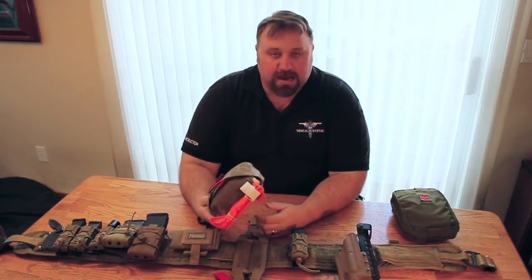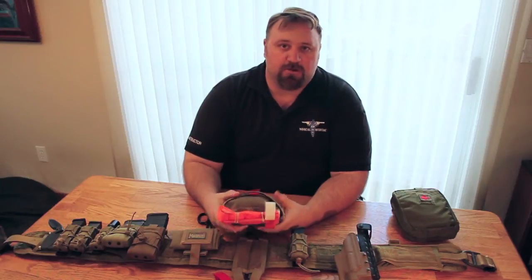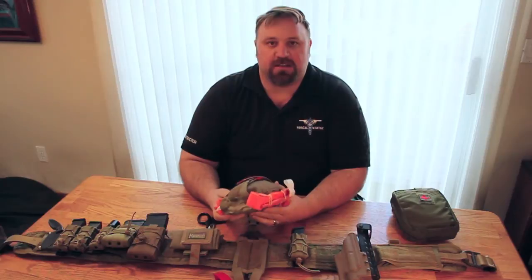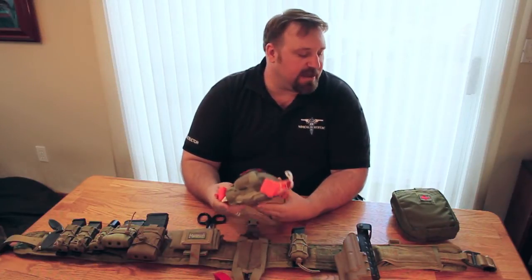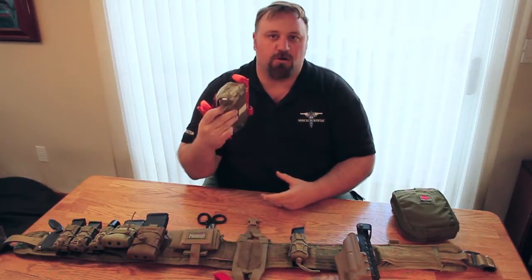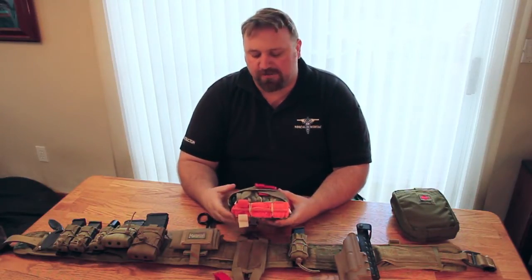This is a really great concept when you think about who's going to be using this kit — if they're going to be using it on you, where you may be injured. It just does not make any sense to have something so fixed to a piece of gear, whether that be a vest, a bag, or your belt, that you can't actually get the whole kit off and be able to move with it without spilling the contents all over the place.